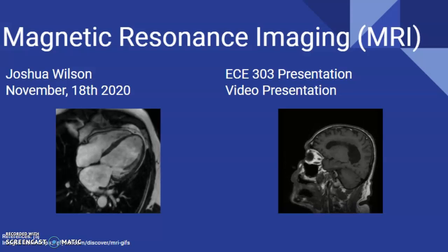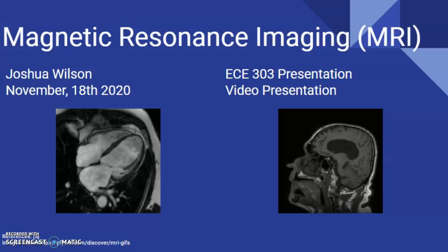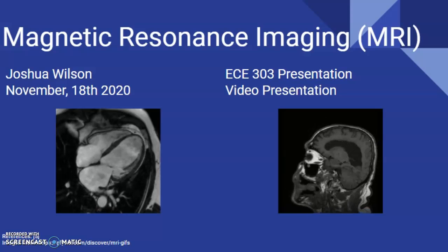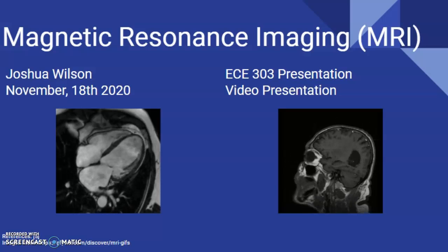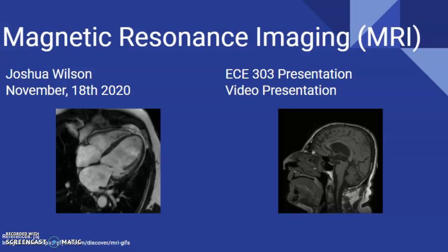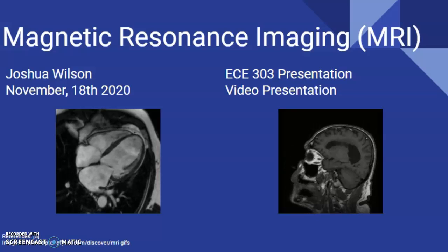As shown in the slide, MRIs are commonly used to treat patients by allowing medical professionals to view organs and structures within the body. This non-invasive treatment is used 40 million times each year in the United States, and has been used to help cure millions of patients.